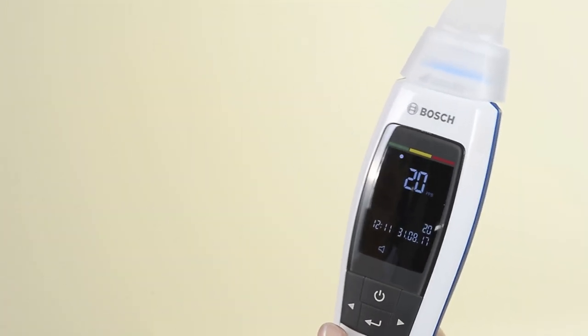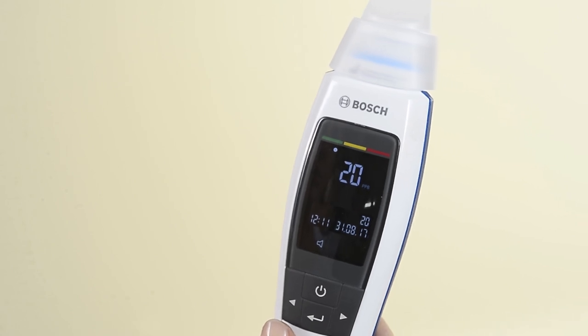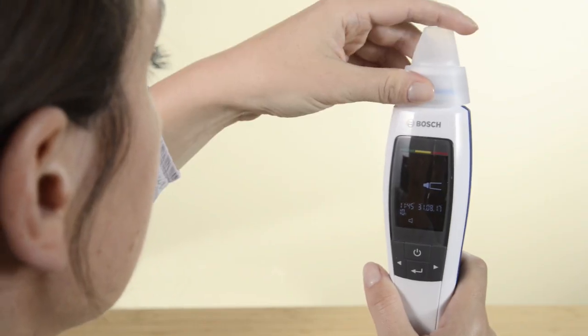The measurement result will be indicated directly on the display. You can make an initial assessment of your value based on the traffic signal colors. After the measurement, simply discard the mouthpiece in your household garbage.